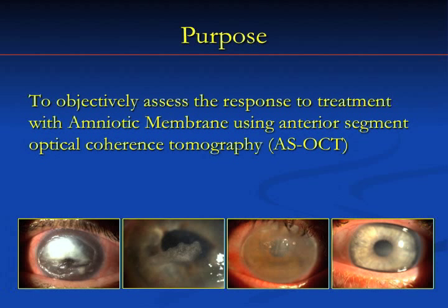So the purpose was to see not only clinically and practically looking at the slit lamp of the benefit, but also to have an objective way in order to monitor the benefit of the treatment. And this was using anterior segment OCT.